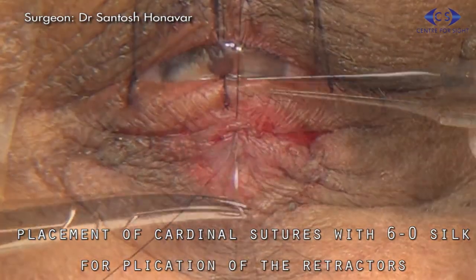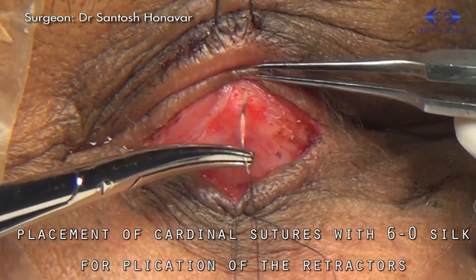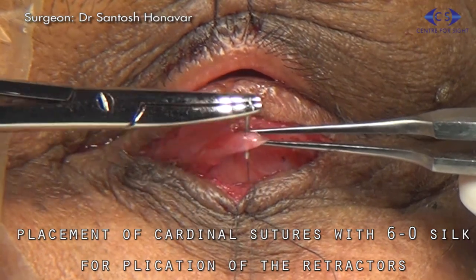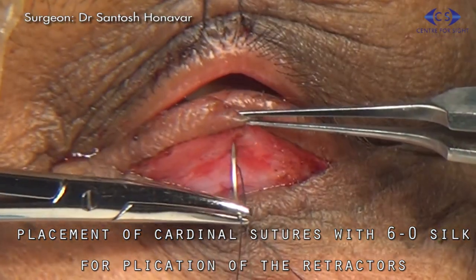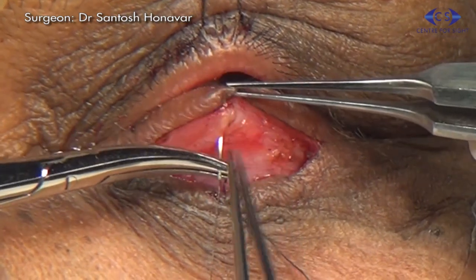The retractor is reattached to the inferior border of the tarsus plate using three cardinal sutures passing through skin, orbicularis, lower eyelid retractor, tarsus plate, orbicularis, and skin with 6-0 silk suture.